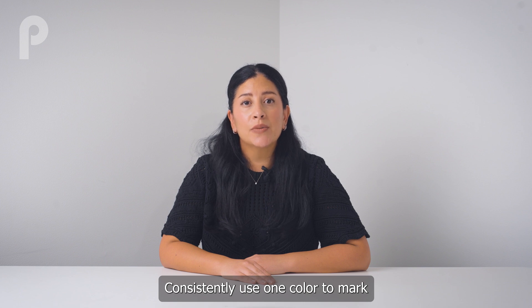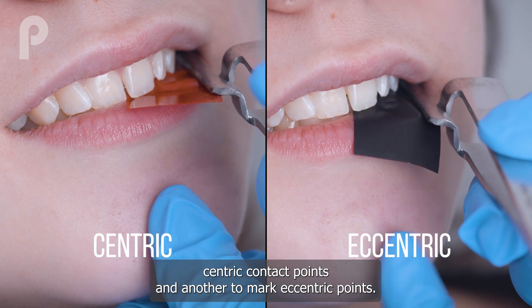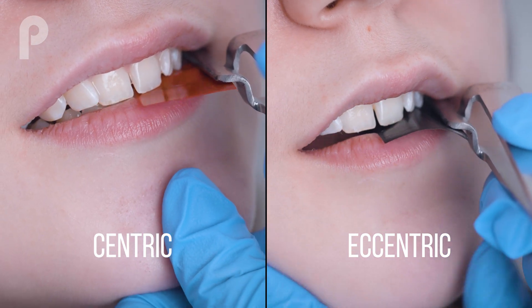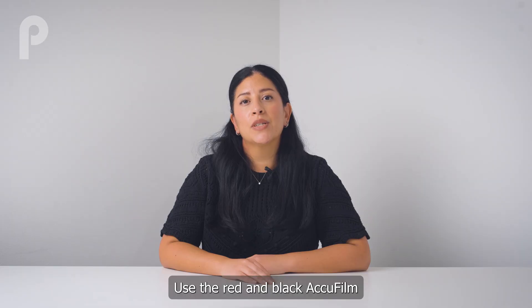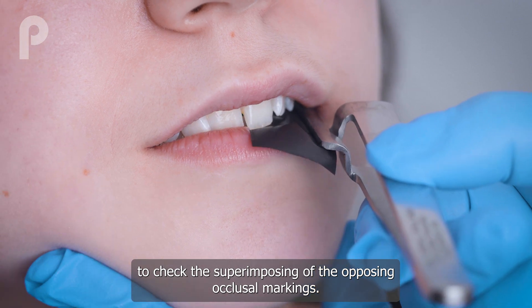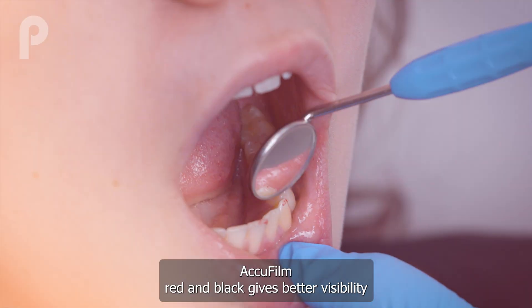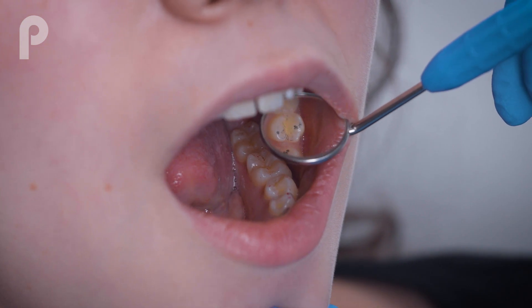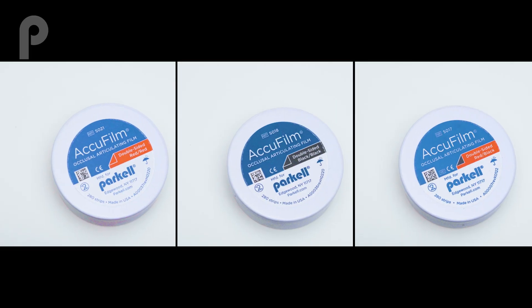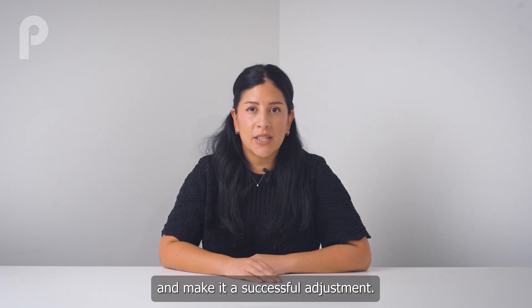Consistently use one color to mark centric contact points and another to mark eccentric points. Use the red and black AccuFilm to check the superimposing of the opposing occlusion markings. AccuFilm red and black gives better visibility and helps to distinguish centric and eccentric occlusion, saving you time and making it a successful adjustment.